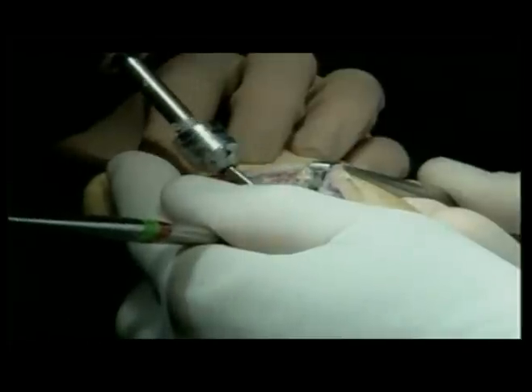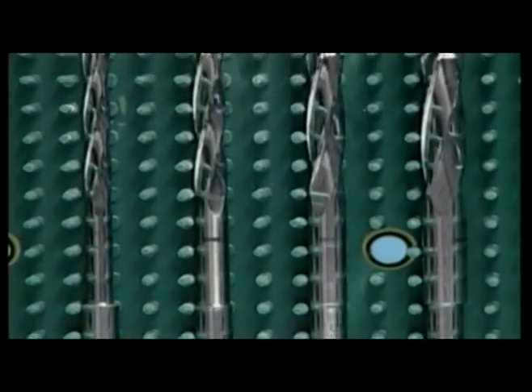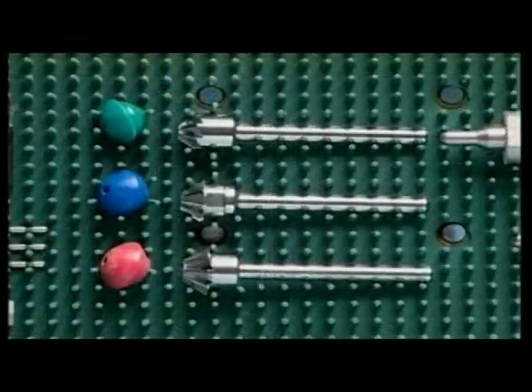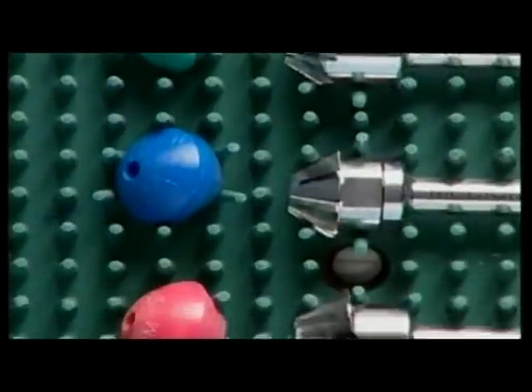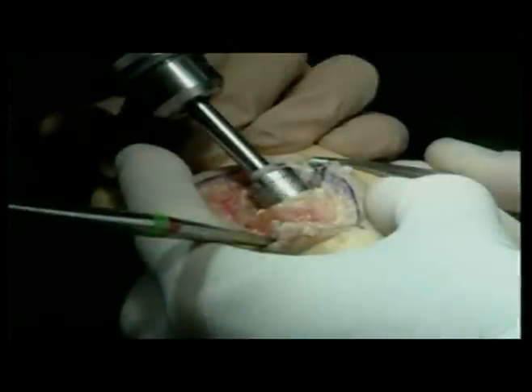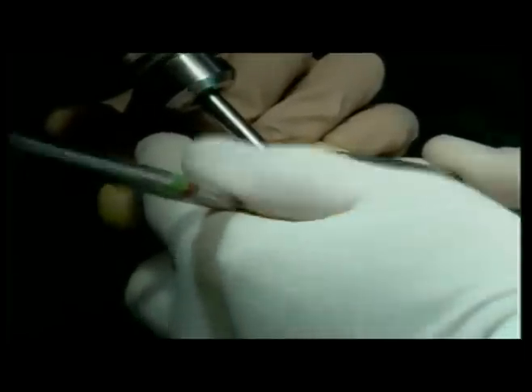Once the appropriate reaming depth has been established, the diameter can be expanded if desired. First ream with the medium, and then if necessary the large straight reamer. Then proceed with the medium cone reamer and, if necessary, the large cone reamer to expand the diameter of the cone. It is important to check the position of the reamer teeth with respect to the plantar cortex. Final implant position should not impinge the sesamoid apparatus, and the cortex should be left sufficiently thick to support weight bearing through a solid shelf of plantar bone.